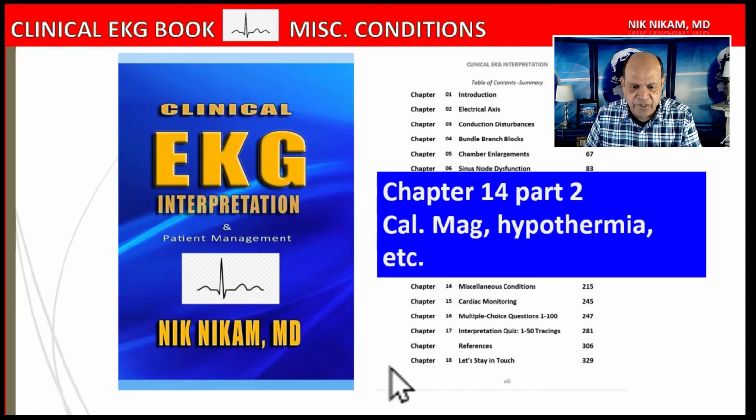This is a clinical EKG interpretation, chapter 14, part 2. Here we're going to be looking at calcium, magnesium, hypothermia, and much more. So let us begin with the feature presentation.